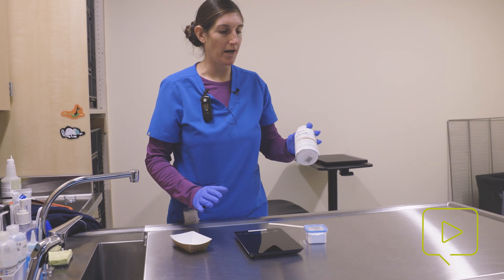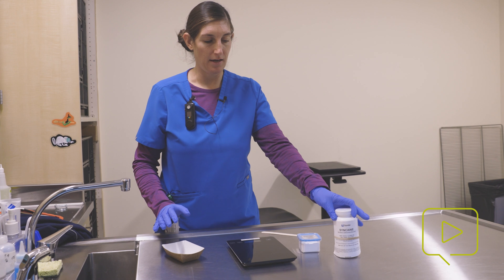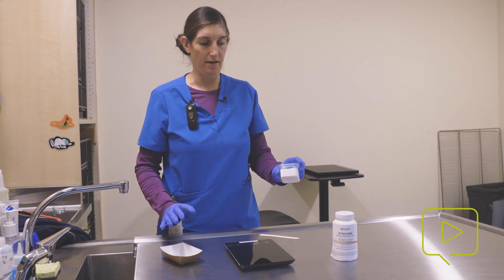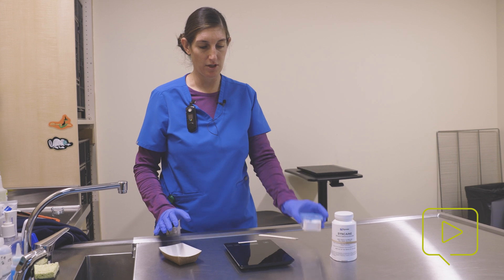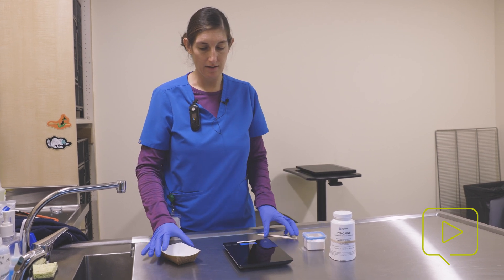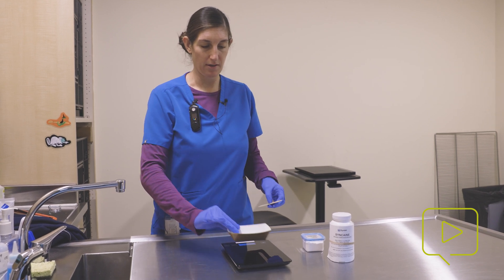What you need is this — it's tricaine, or MS222, a fish anesthetic. I've also got plain sodium bicarbonate, or baking soda, to buffer the solution. And I have a gram scale and a small container to weigh out what we're going to be using.